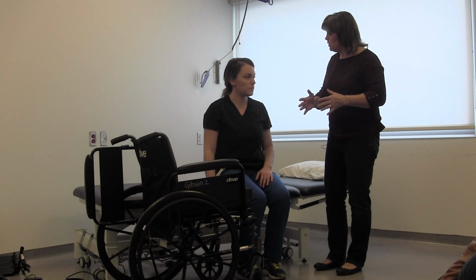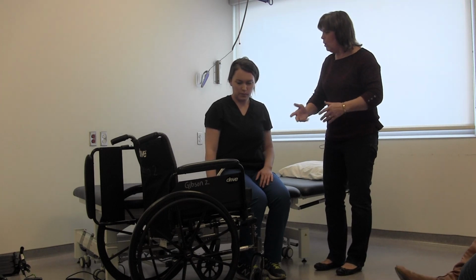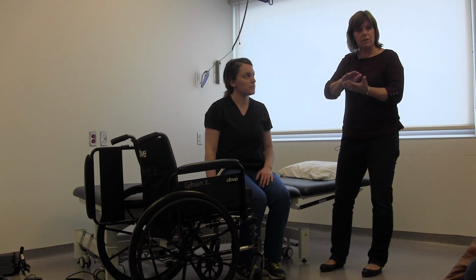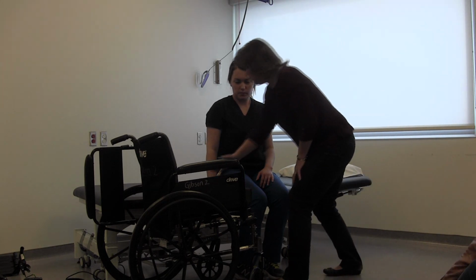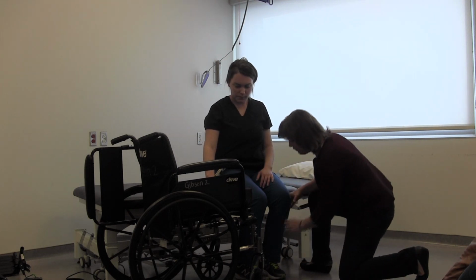And the thing is, when we do a sit pivot transfer, we're not coming right up into standing. We're going to stay low. What we're going to do is help her shift her weight so that her hips are unweighted just enough on the bed, and then we're going to pivot over. And when we first pivot over, we're just going to pivot right here. Okay? So I'm going to make sure that her feet are in alignment.